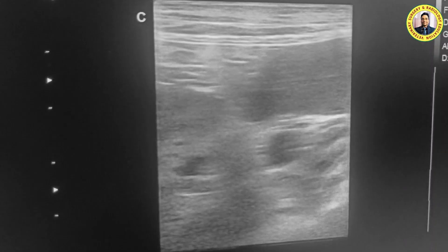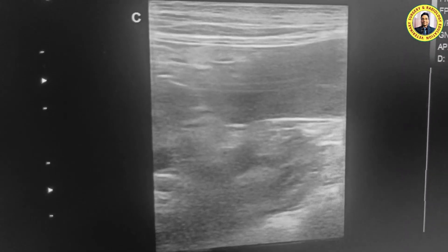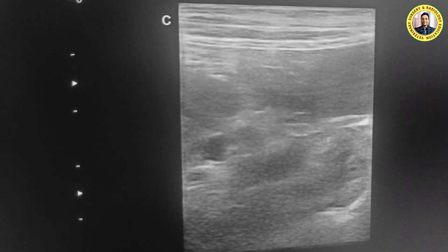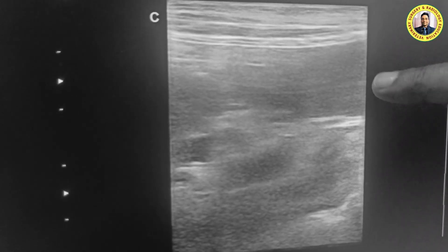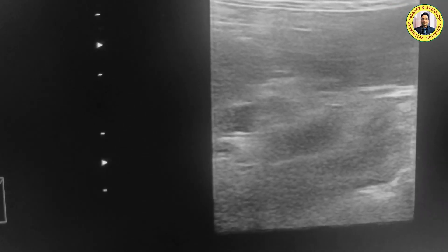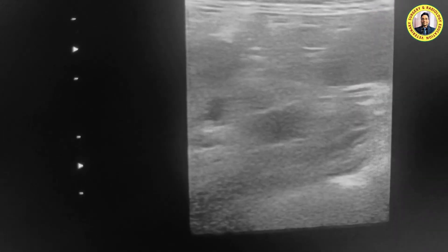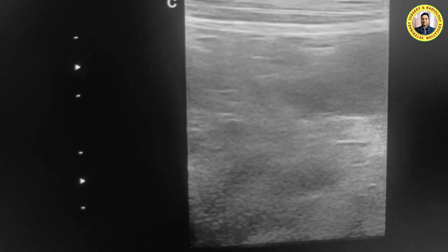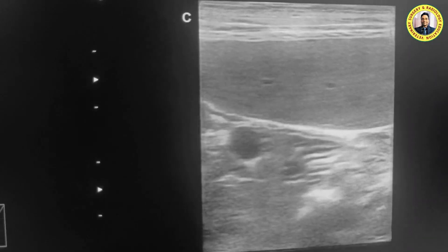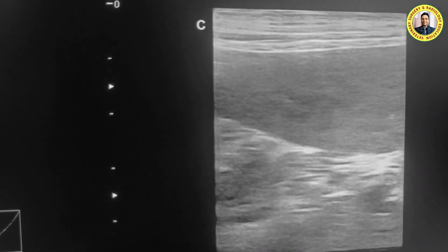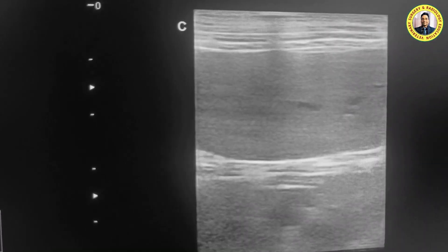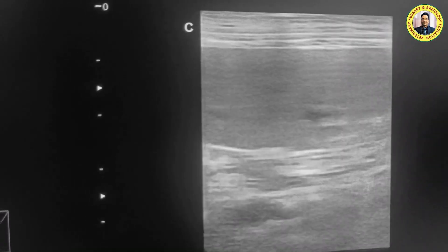Let me freeze the image. Now you can see this is the spleen and this is the tumor, and it is in continuation with the spleen. You can also see the blood vessels and the spleen parenchyma clearly.